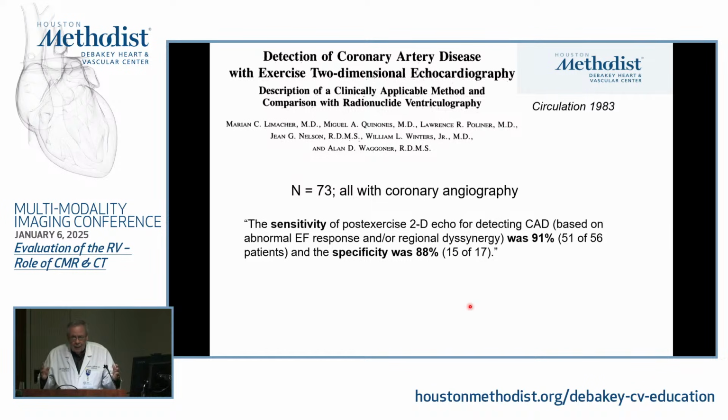Okay, a little bit of a historical point. This is 1983, and this is the paper that puts treadmill stress echo on the map.